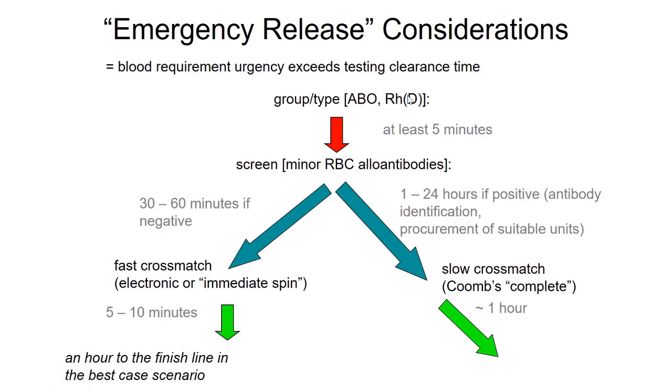And so the theory here is that you can get to the finish line within an hour if you are lucky enough to be screen negative, but we can't promise that in all cases for those who are unfortunately found to be screen positive in this emergency situation.